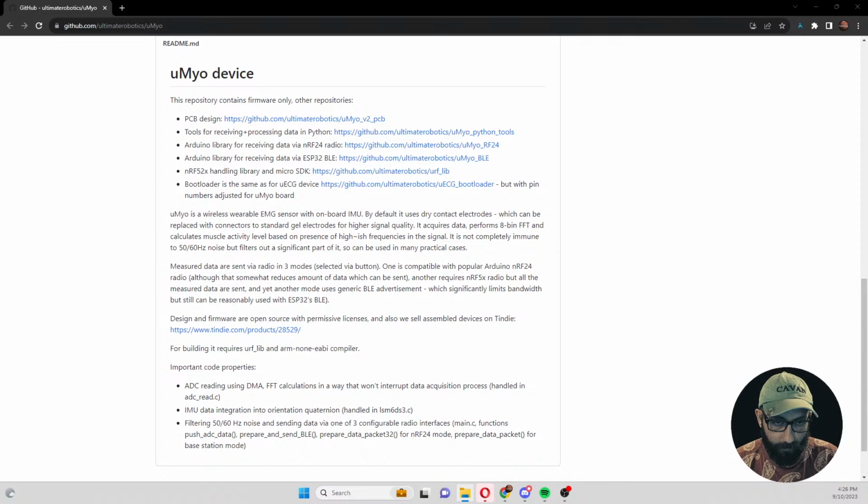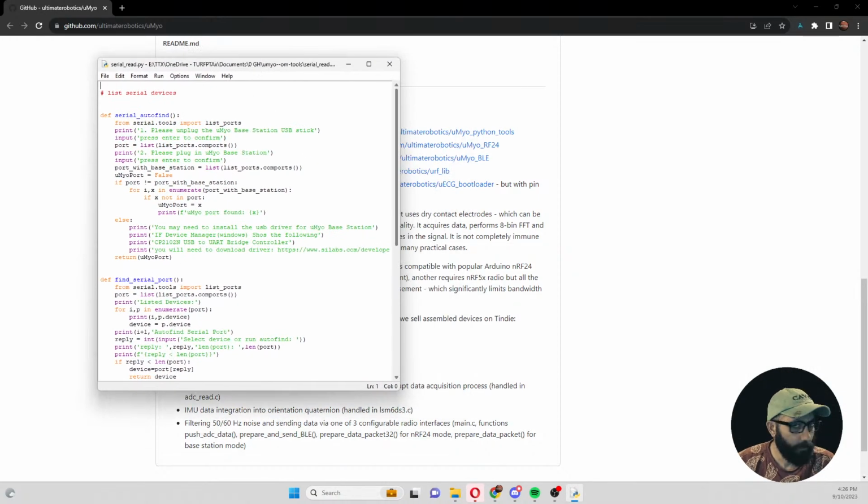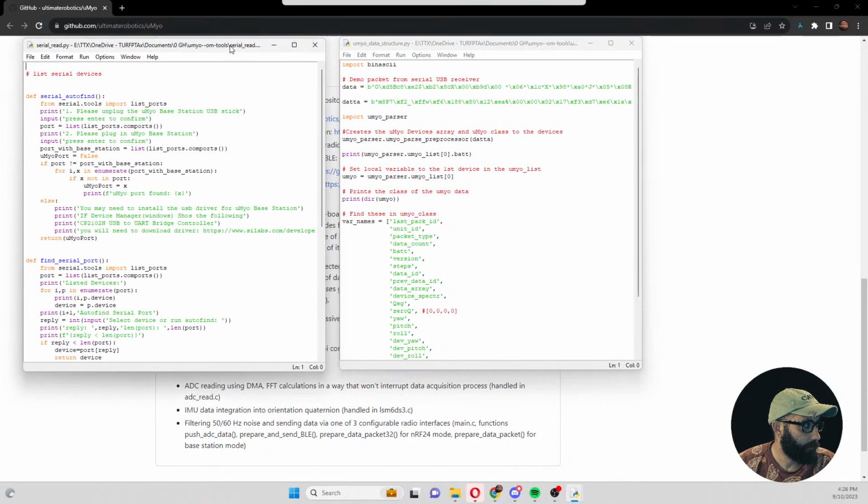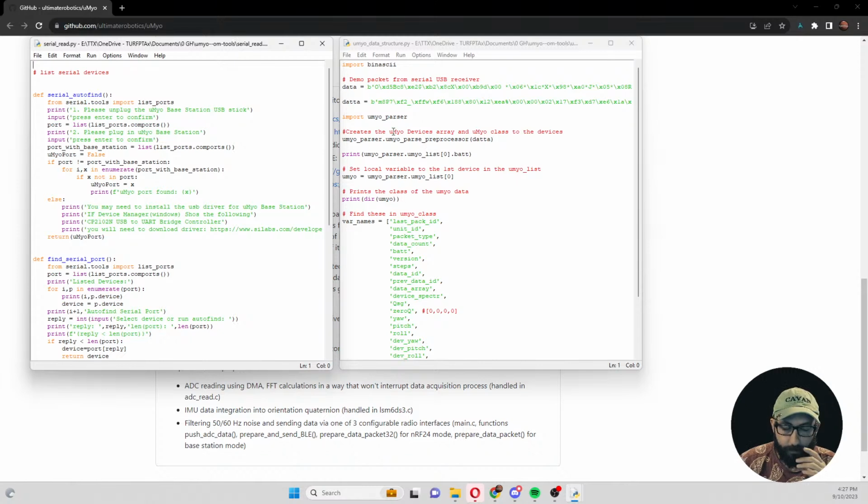Serial read. Okay. And let's open up uMyo data structure. So this is how we are going to be able to take in the data. So one is coming from UDP packets, and the other one is coming from the USB dongle. The uMyo is going to be receiving it. So we're going to have to actually capture both data points at the same time.